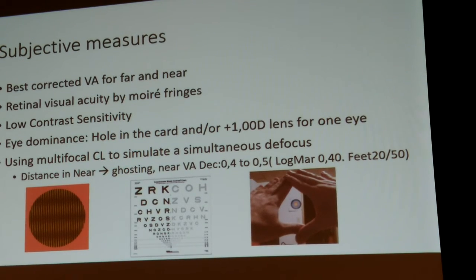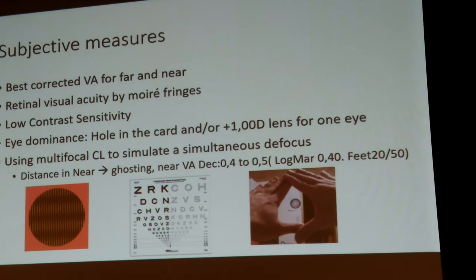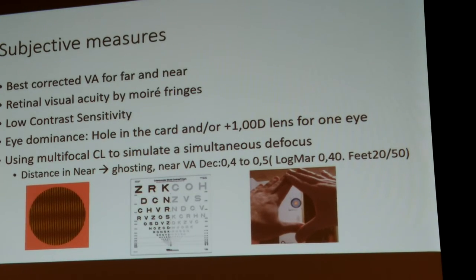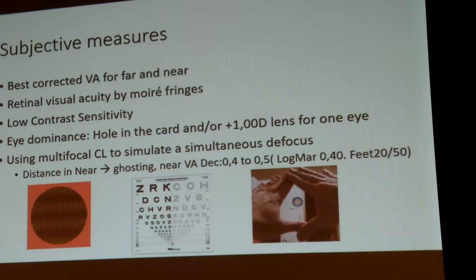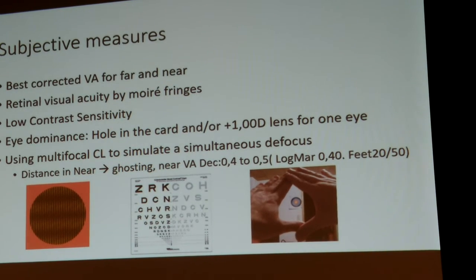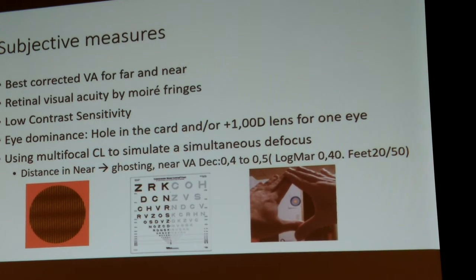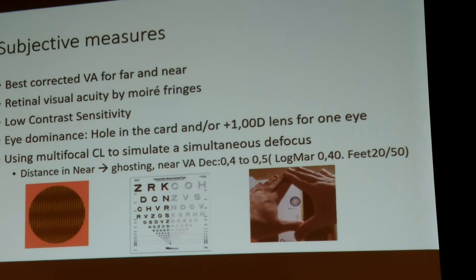But I think with this one, we make quite good experiences, and as a patient, you get an idea how it could be. And the contrast is a bit low, and you know, oh yes. It's not like the usual multifocal or progressive glasses where you have to target where you look through, because with the lenses you can just look near, far, and that's it.